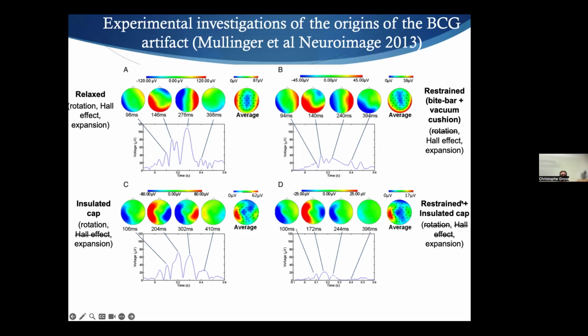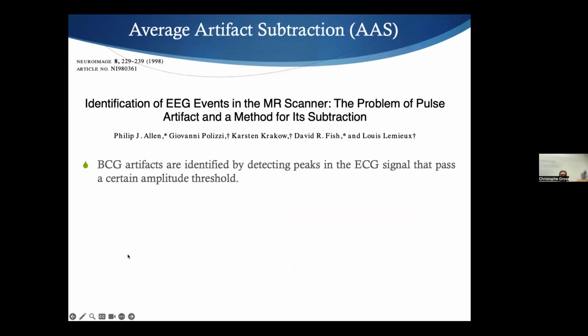And then they combined the two, so the restrained and insulated cap. So if you don't move and if you don't measure EEG, the only thing that should remain is these little expansions due to the vessels. And so you see very clearly that the main effect here, it's small, the main effect is there. So you see that the main effect was due to rotation of the head. So this is what we know.